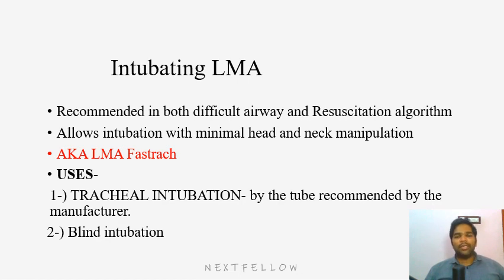So fast track and intubating LMA are the same. Only the company which started producing it gave the name fast track. It is recommended in both difficult airway situations and the resuscitation algorithm, so in both scenarios it can be used. So it is very useful. It is very costly, so that's why most hospitals can't afford it.